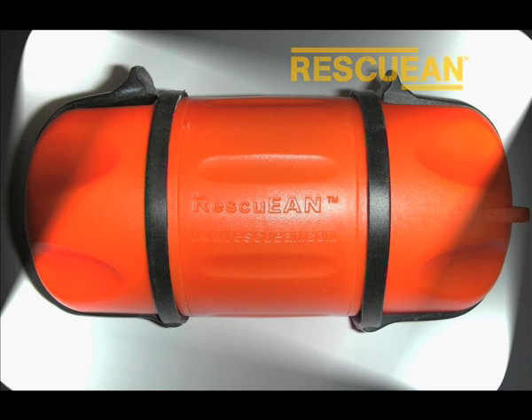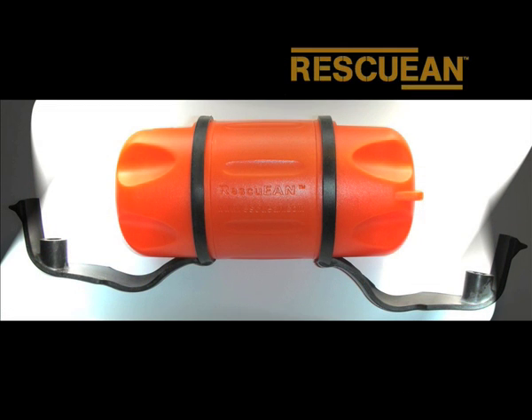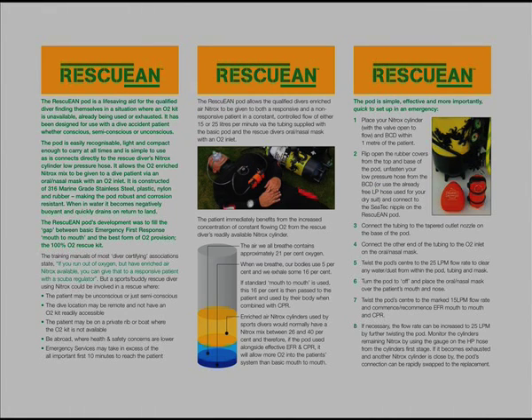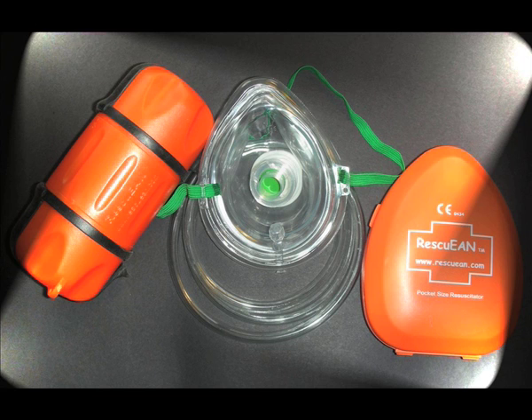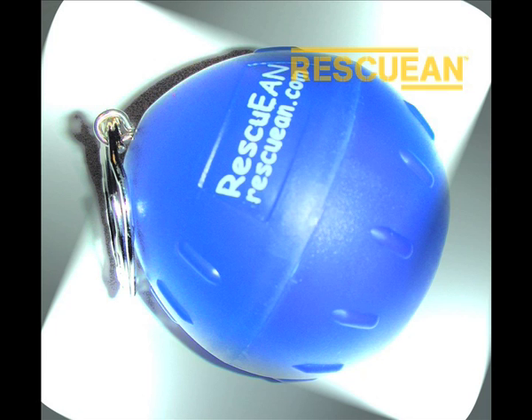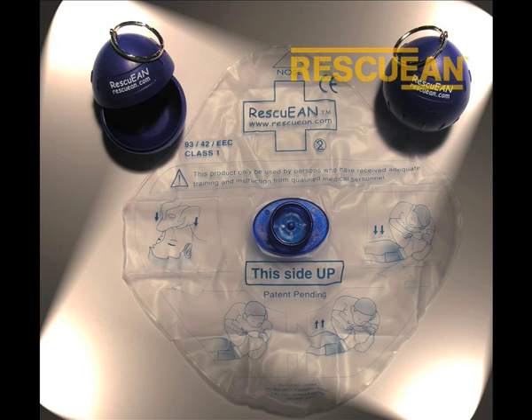The Rescue EAN pod is easily recognisable, light and compact enough to carry at all times, simple to use, robust, corrosion resistant, and in water becomes buoyant and quickly drains on return to land. Each pod comes complete with tubing and a full set of instructions. The Rescue EAN plus kit includes a pocket mask with O2 inlet, tubing, and the pod itself. Also available is a useful compact key fob containing a face shield, handy at all times for any EFR emergency.